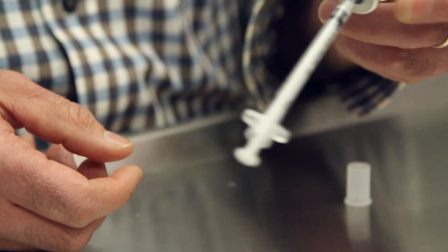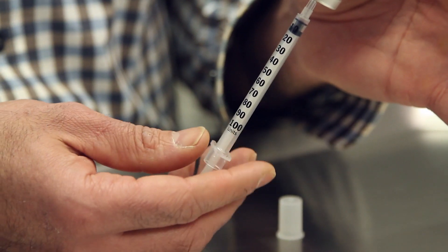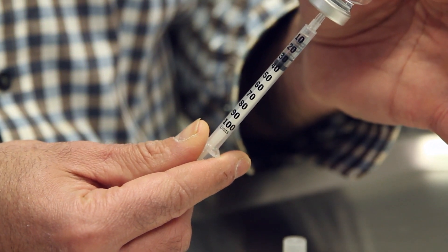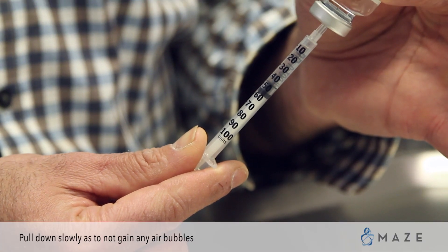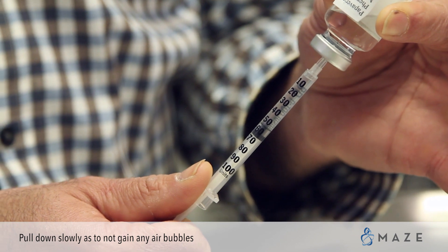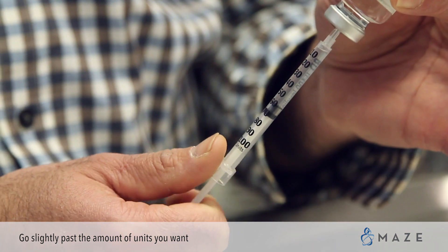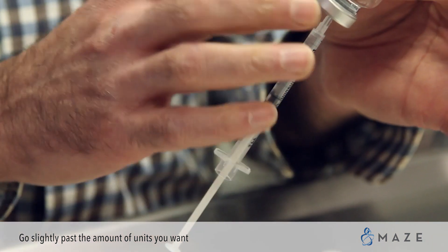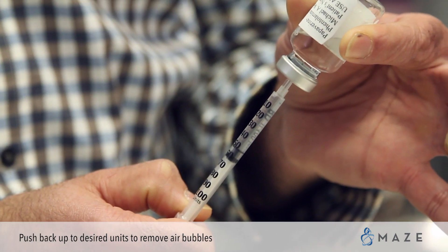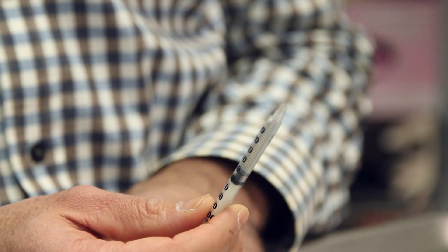Flip the bottle over and draw down on the syringe. As you pull down, fluid will start to fill into the syringe. Pull down slowly so as not to introduce any air bubbles. Pull past the 50 unit mark to 55 or 60 units. Then, with the needle still inside the bottle, push up to remove any air bubbles. Once you get back to 50 units, pull the needle out and you are done.